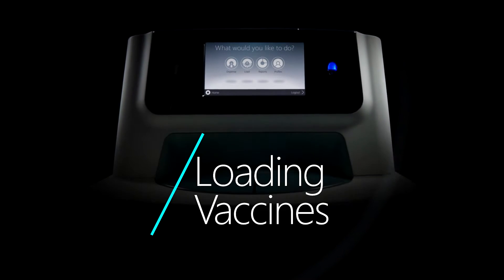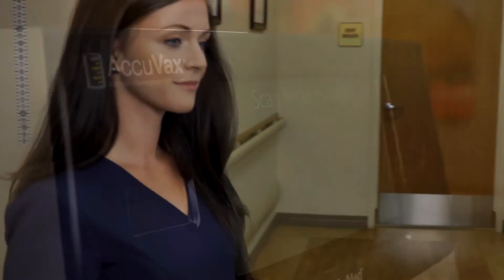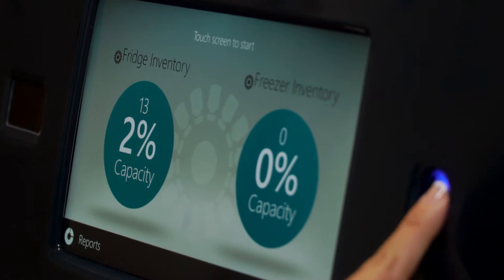Loading vaccines into your Acuvax system is safe, simple and secure. First, log in using the secure fingerprint scanner.